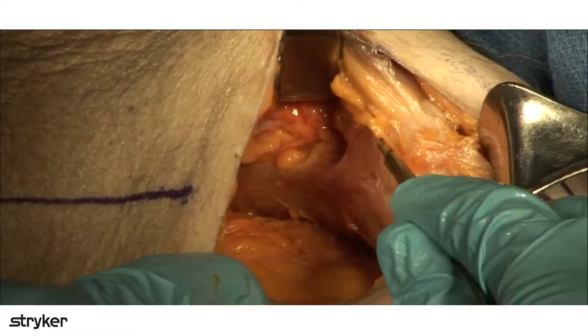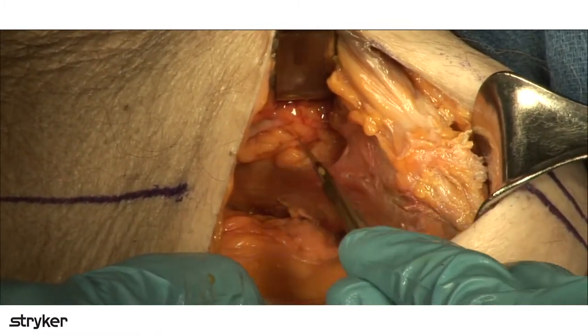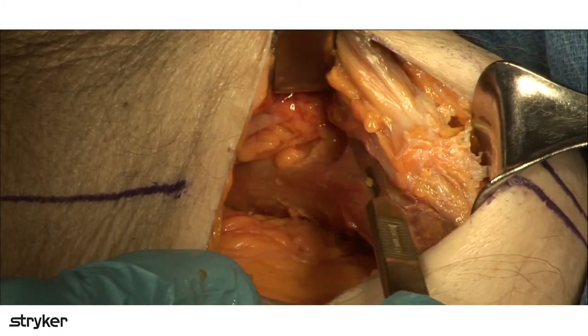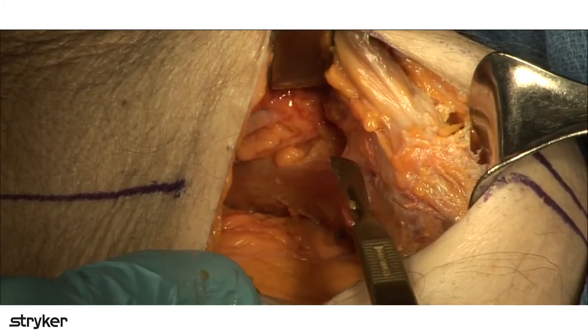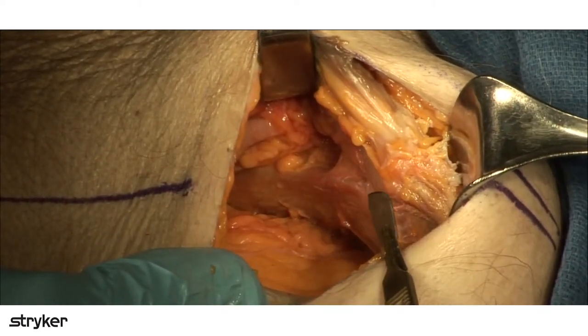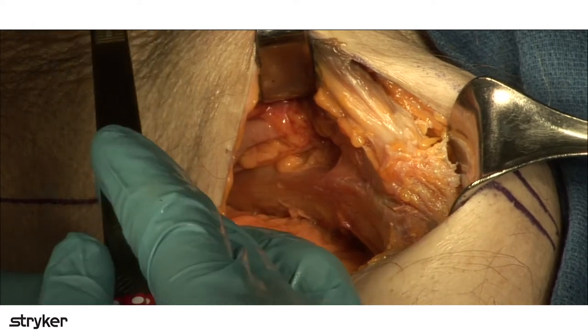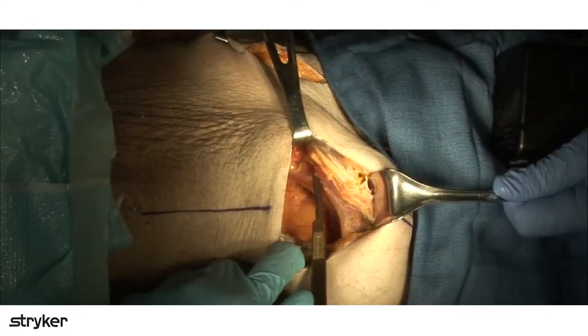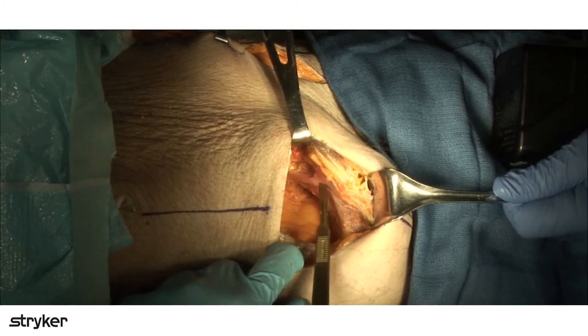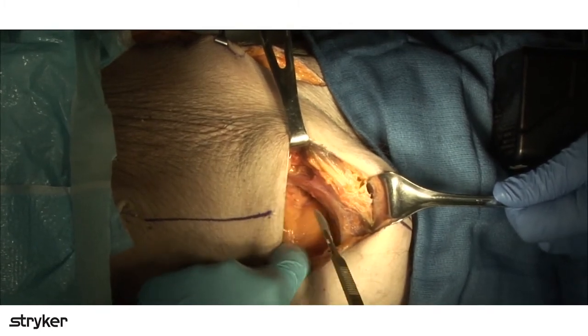So just like the ilioinguinal, you're going to have to deal with the iliopectineal fascia. This is the reflection of the iliopectineal fascia right here. So when you do an ilioinguinal and you start with window number 1 over here and you start working your way this way, the way that you get from the false pelvis into the true pelvis is you release the iliopectineal fascia. We come down through window number 2 and cut it and take it off the ramus. When you do an AIP, it's just the reverse direction.